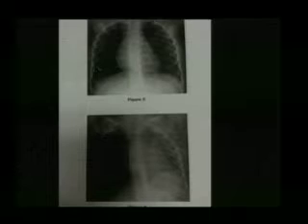Okay. We will let Daniel take this one. This is the inspiratory chest X-ray. This is left lateral decubitus, and this is right lateral decubitus. So they're doing this to evaluate for a foreign body. Correct. They put the patient on his left, and then the right got hyperexpanded. Correct. And this one got lower volume, gets smaller. And then they put this on this side, and then they're about equal. Okay. So I believe there's an obstruction or a foreign body on which side? Right. Correct.